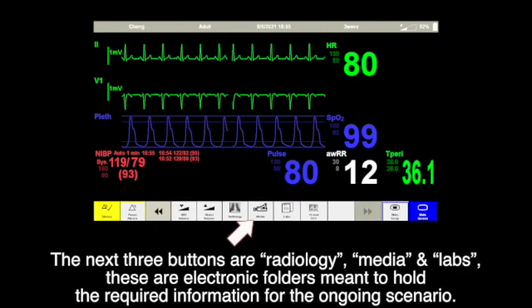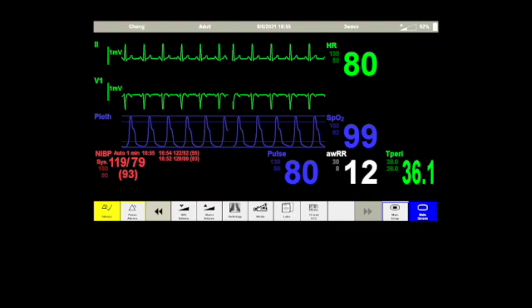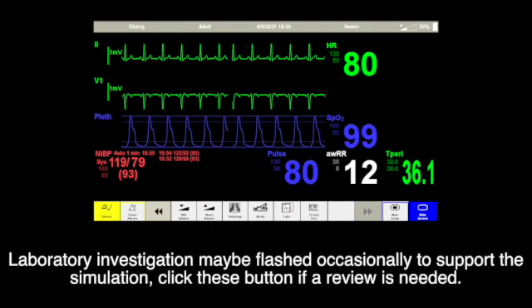The next three buttons are radiology, media, and labs. These are electronic folders meant to hold the required information for the ongoing scenario. Laboratory investigations may be displayed occasionally to support the simulation. Click these buttons if a review is needed.